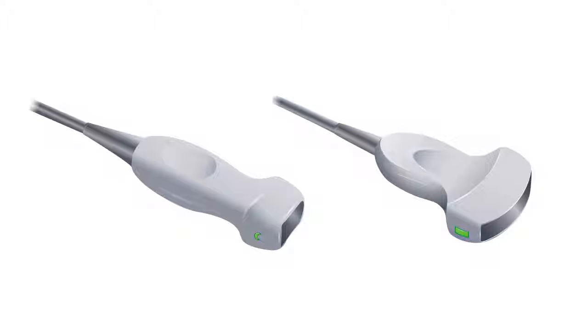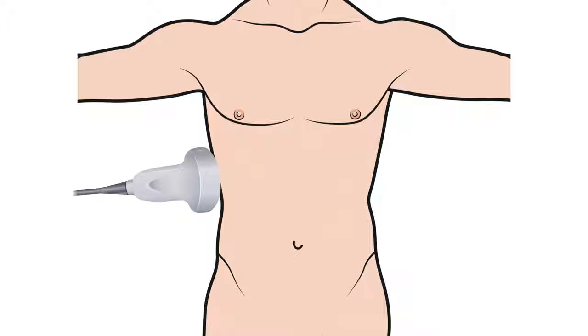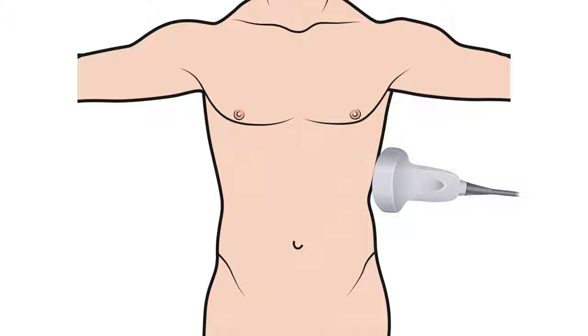The FAST exam will be performed with a curvilinear or a phased array probe in an abdominal preset. Abdominal preset means that the indicator will be pointed towards the patient's head or towards their right side. Our first view is going to be a subxiphoid view, indicator pointed towards the patient's right side. Then we're going to do an IVC view, which is a sagittal view of the IVC as it goes through the liver to enter the right atrium, indicator towards the patient's head. A coronal right upper quadrant, indicator towards the head. A coronal left upper quadrant, indicator towards the head.